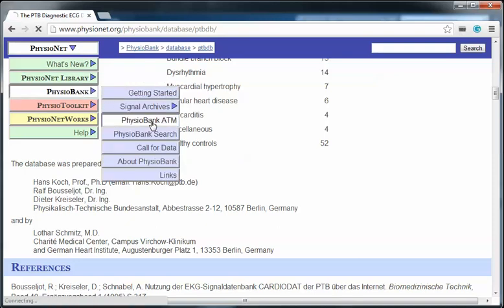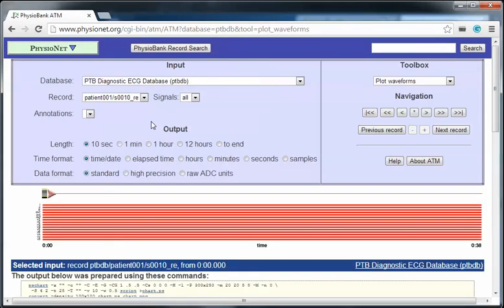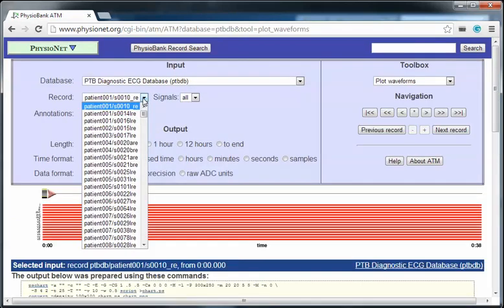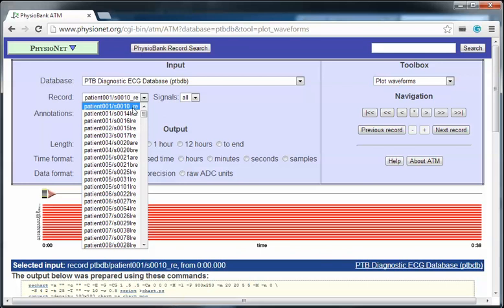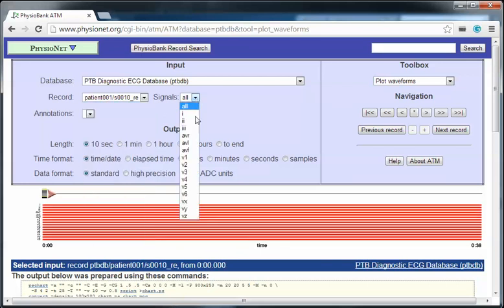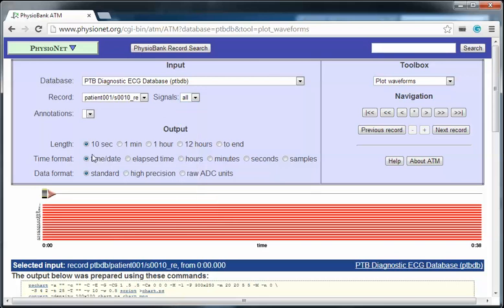In PhysioBank ATM, here you can select which record of this database you want to download and also here you can select which particular leads you want to download. In this part you can mention how long of the data you need and you can say about the time format.